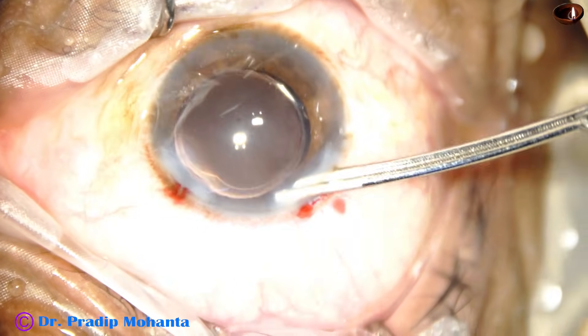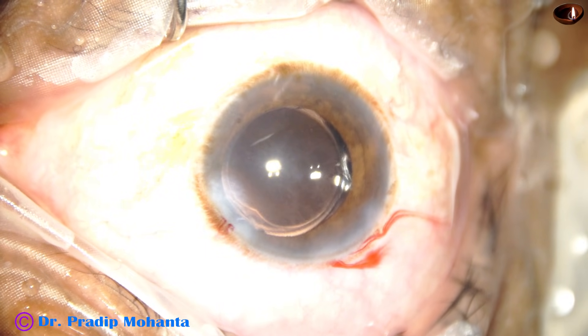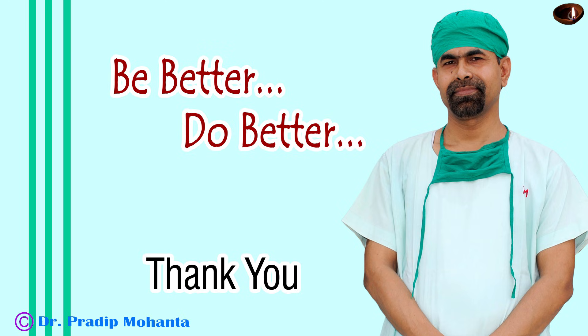The anterior chamber is nicely formed. Integrity of the wounds is checked. A few drops of moxifloxacin is applied over the ocular surface, and the case is concluded. Thank you very much for your attention. Hope this video will help you in developing your skills. Please try different techniques, improve your skills, and customize a particular technique for a particular patient.